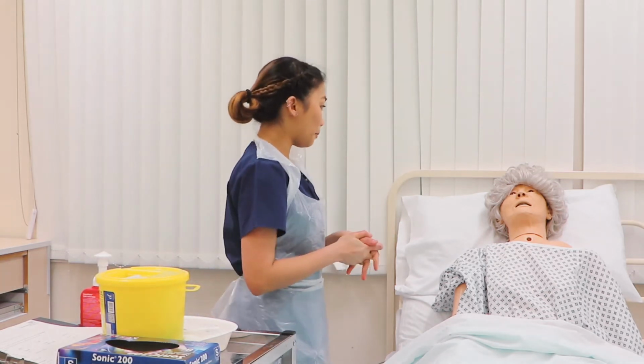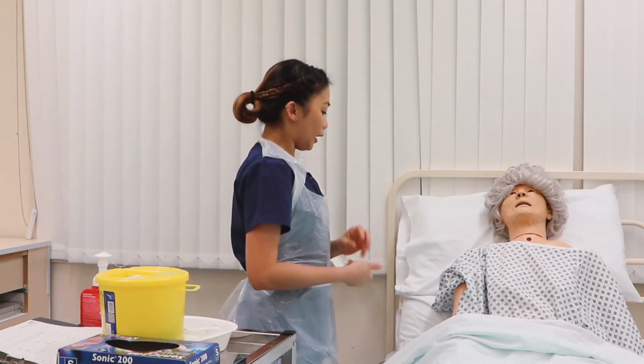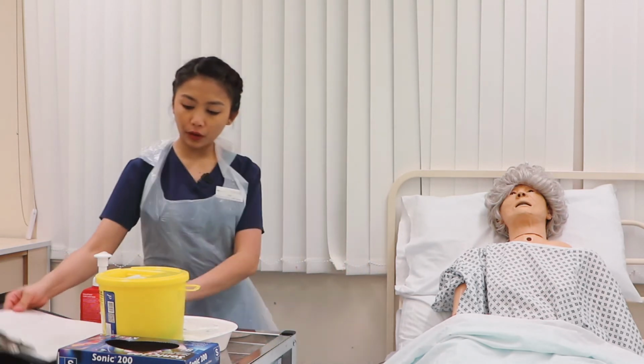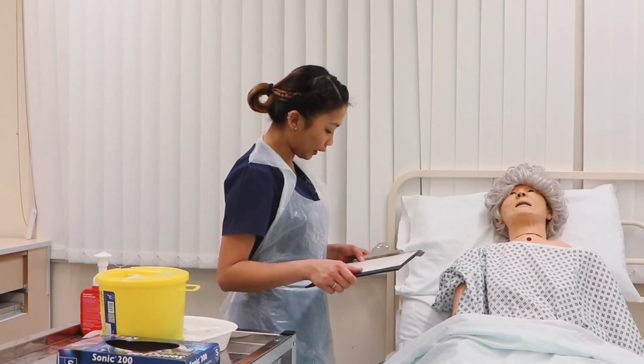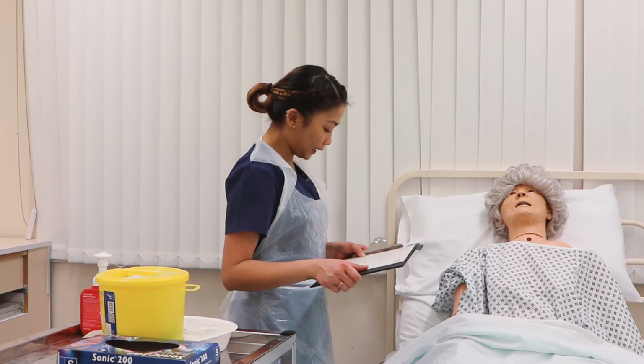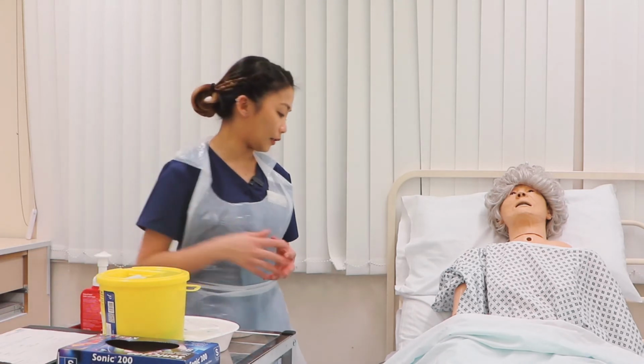Hi, Andrea, I am back with your medication. Are you comfortable? Alright. Before we proceed, is it alright if I do a second identity check? Can you just confirm to me your name and your date of birth, please? Yes, it is. Andrea Jones, 5/8/1990. That's the same as my notes. I can confirm that I have the right patient.